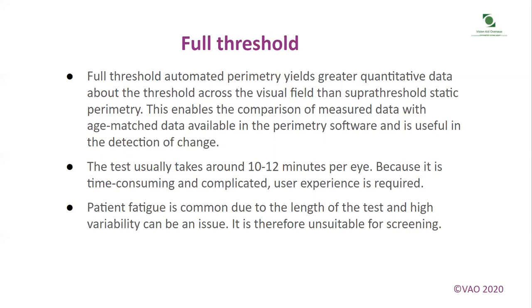Because it is time-consuming and complicated, user experience is required. Patient fatigue is common due to the length of the test, and high variability can be an issue. It is therefore unsuitable for screening.